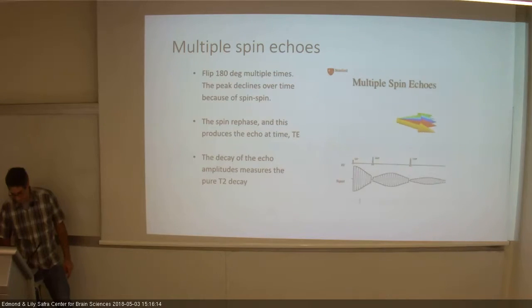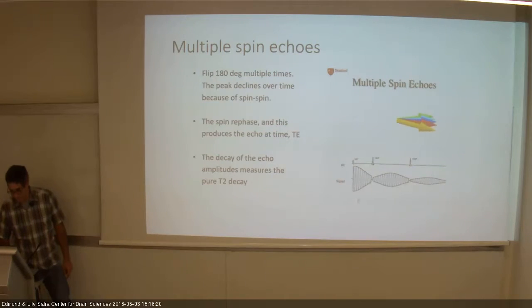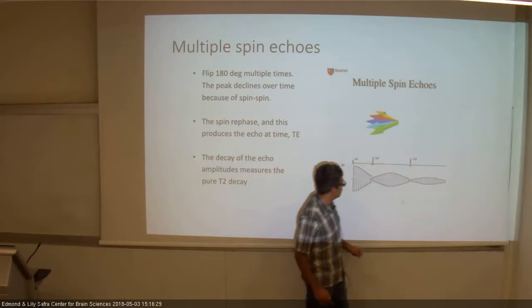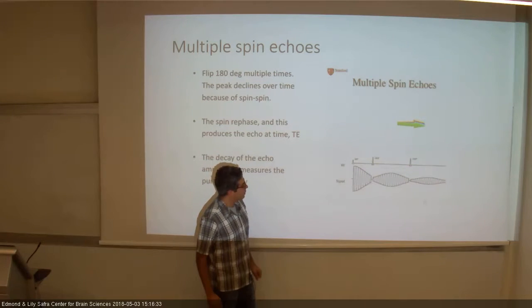I don't understand exactly. So he injected a second, like, rated frequency? Yes. Flip it? Yeah, this is the 180. If you would see here for a second, there will be also a curve that was fitted along these lines, along the center. I cannot pose it in this one. I don't know why. It's going to come in a second.